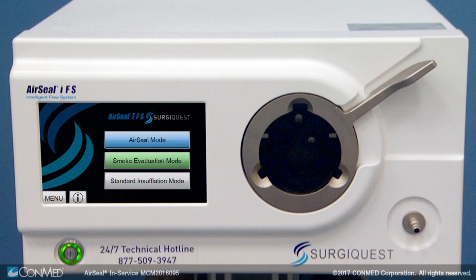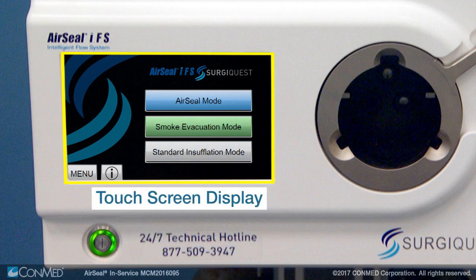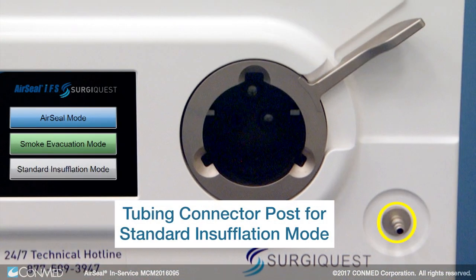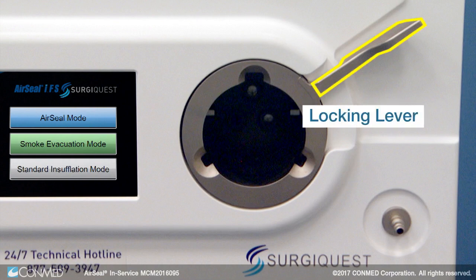To begin, let's review the different components of the IFS unit itself. Located on the front of the AirSeal IFS unit, you'll find the on and off switch, the touch screen display, the tubing connector post for standard insufflation mode, the AirSeal and smoke evacuation filter receptacle, and the locking lever.